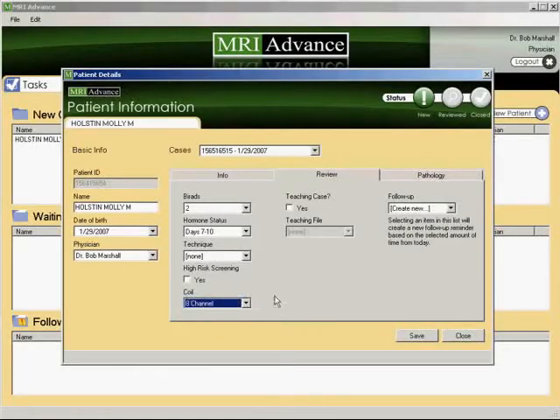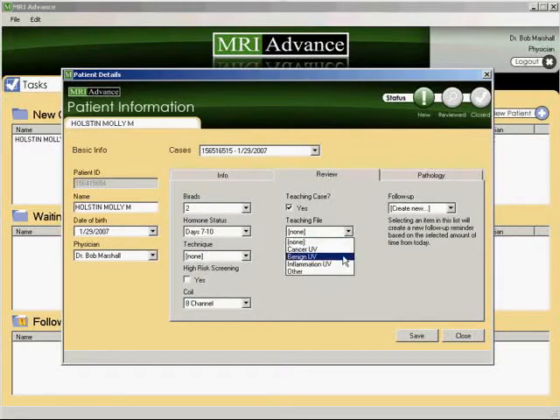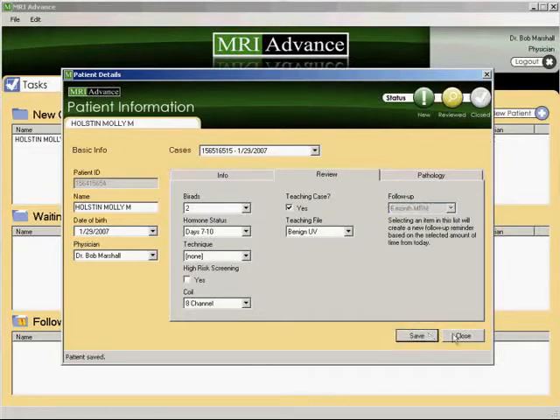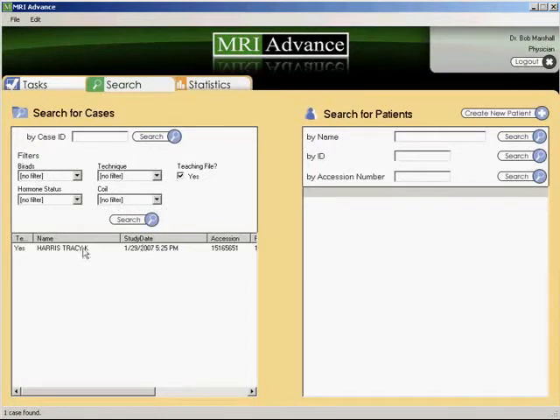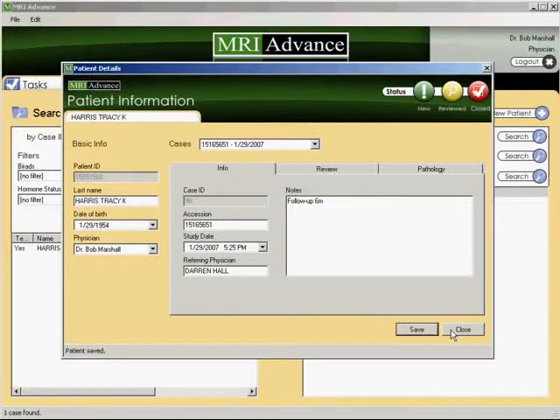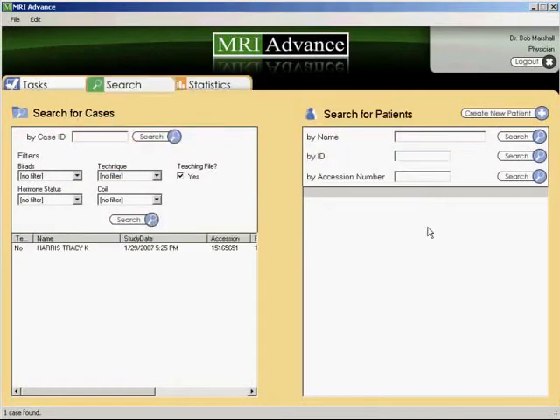A case can be tagged as a teaching file case. Follow-up parameters can be specified; however, automatic follow-up parameters are also provided. Any patient designated as a BI-RADS 1, 2, or 3 will be flagged for follow-up in 13 months. We have designated 13 months to allow some leeway for patients obtaining their routine annual screening mammograms. This will facilitate following your negative or benign MRI exams to assure that subsequent screening exams do not demonstrate an undetected cancer. These cases will be followed for three years before being designated as complete.